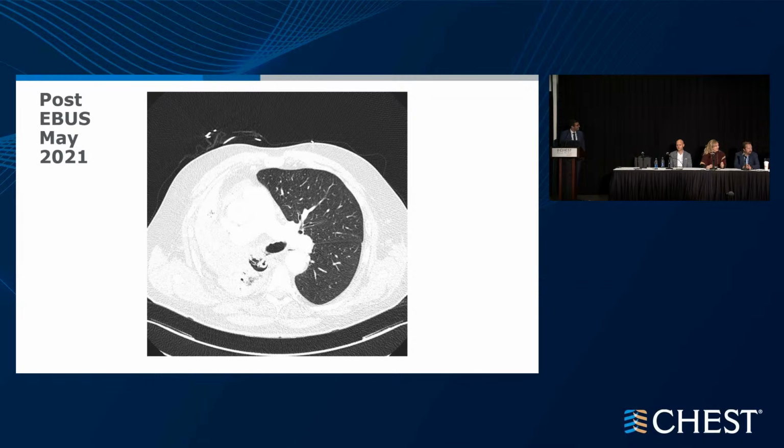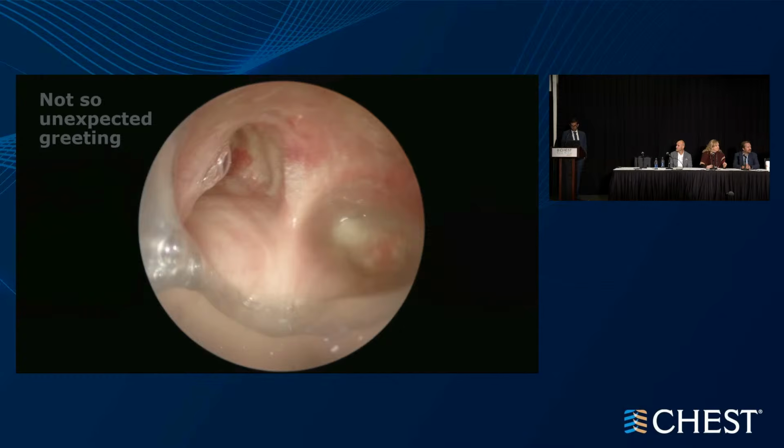Yes. Well, I think we have the information that there needs to be relief of obstruction, so I would probably repeat the rigid bronchoscopy and go in with a ventilating rigid bronchoscope, be able to control the airway, ventilate the patient, and also do a manual debulking, but also maybe have a thermal therapy available in case for hemostasis, whether it be argon plasma coagulation or a YAG laser or something of that nature. Exactly. All right, good. And hopefully this video clip works perfectly.